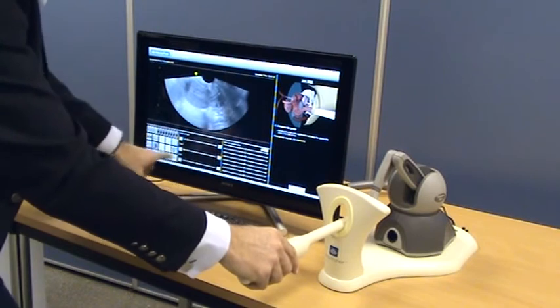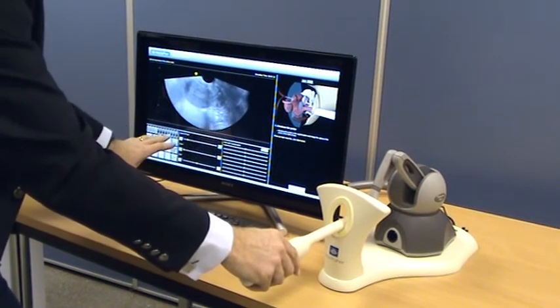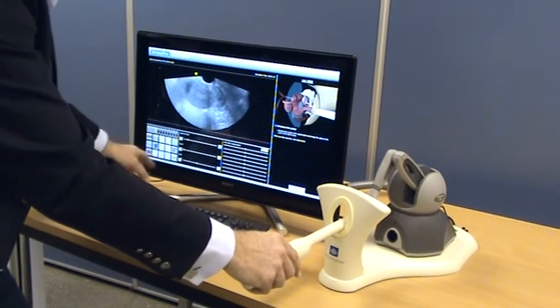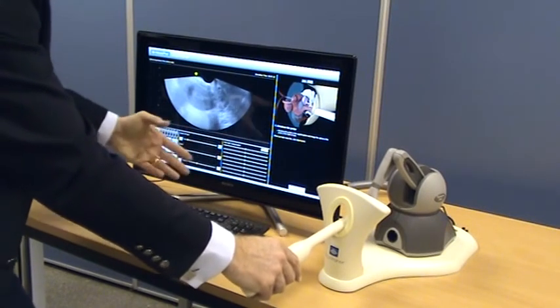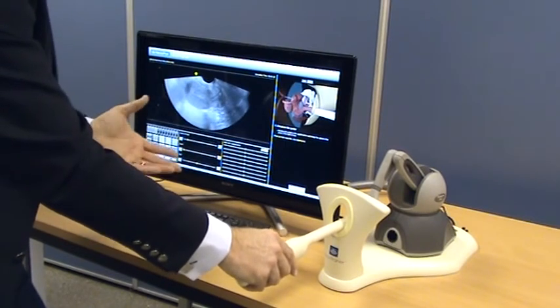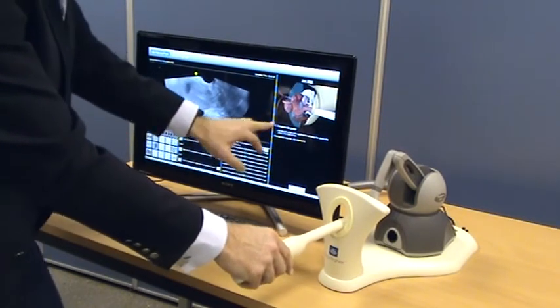The generic dashboard enables you to change a number of fields such as depth of field, zoom, gain, TGC. You can also freeze it, and that brings up other action buttons such as annotate, measure, CRL length, etc. And finally, this becomes your tutor.